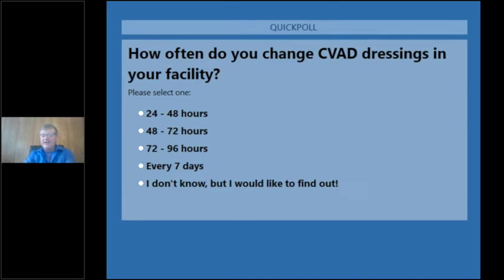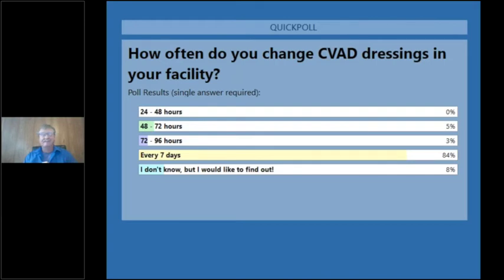I ask this everywhere I go, and invariably I get the same answer, and it's not what you really expect. So it looks like 84% say every 7 days. 84%, and invariably, that's exactly what we hear every place I go.